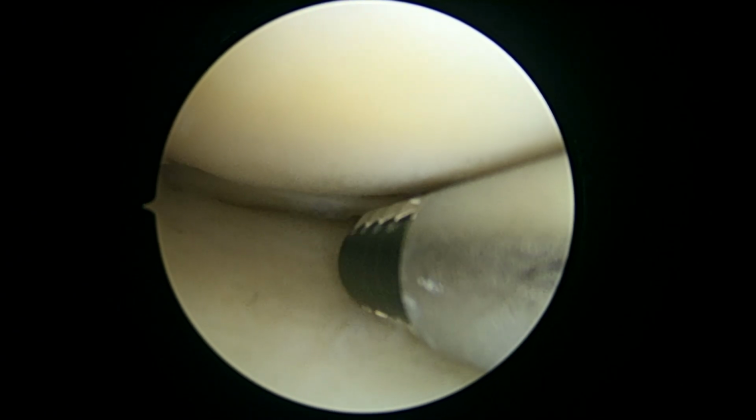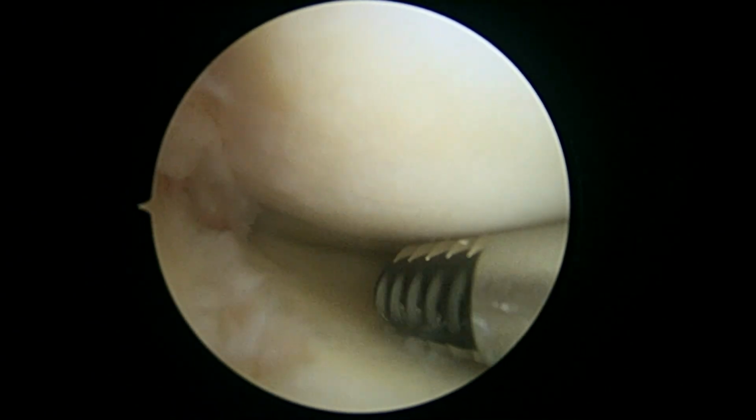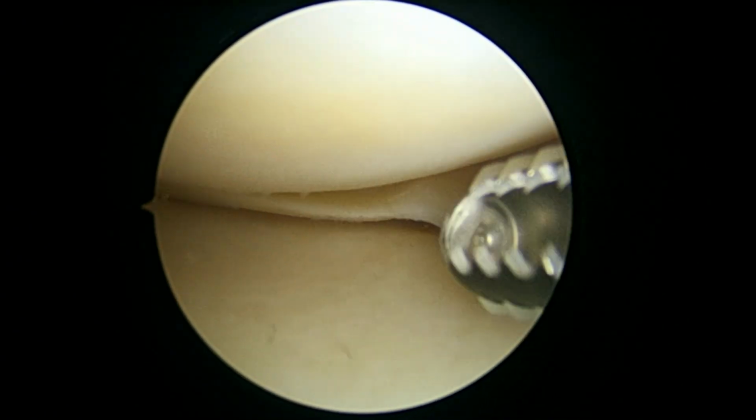Okay, it's Dr. Buford here. We're just getting started on the right knee. We've already harvested some bone marrow and made a nice stem cell injection for you to use at the end.